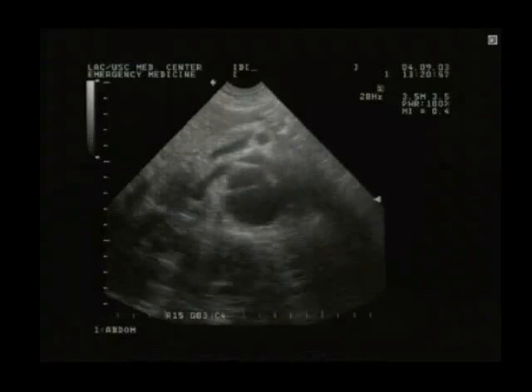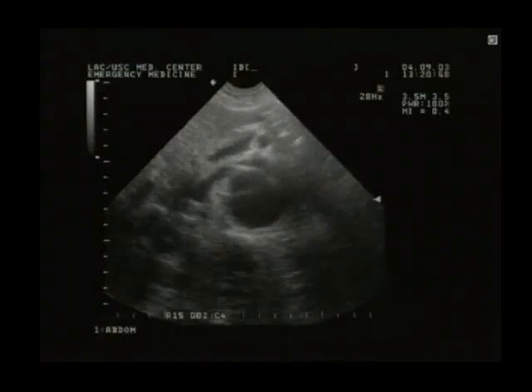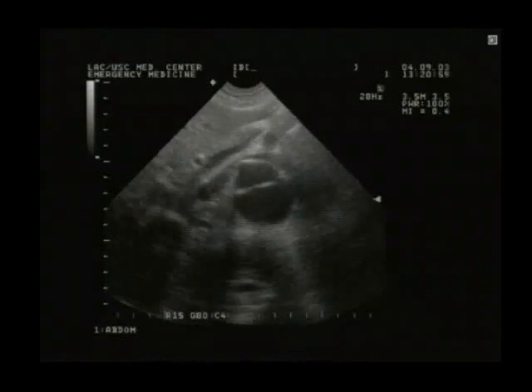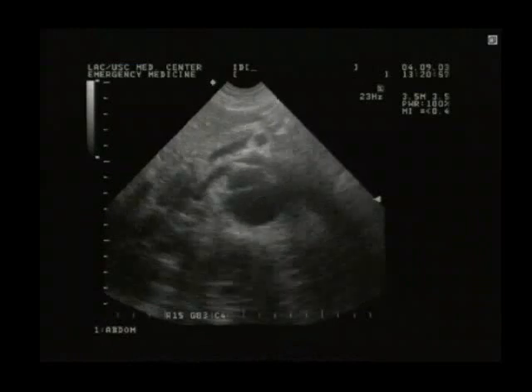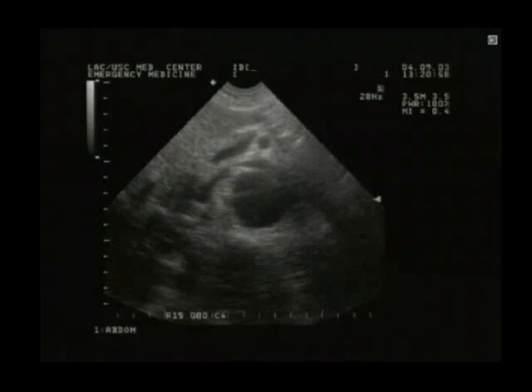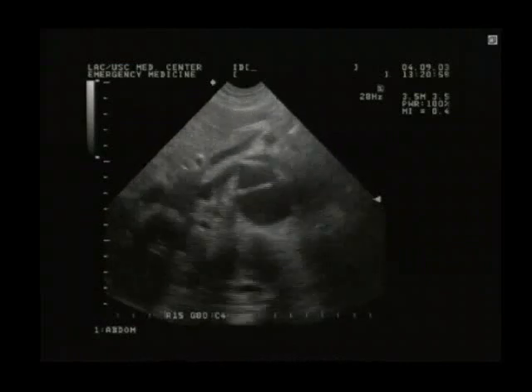Here's another patient with aortic pathology. We're scanning transversely. And you guys recognize that there seems to be almost a septum in the middle of that aorta. The aorta is dilated, so you know that you're done as far as our exam. It's a dilated aorta. They're having symptoms. We're going to call people.